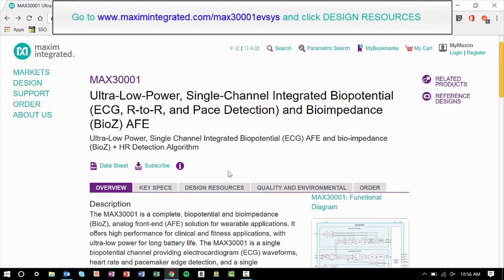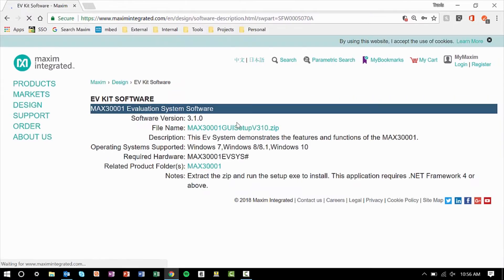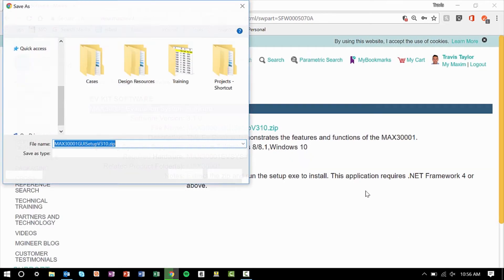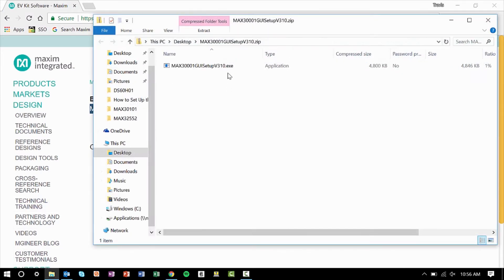The first thing we'll need to do is download the evaluation system software from the MAX30001 design resources page. To download this you'll need to agree to the license agreement and click download. Extract the zip folder and run the executable file to install the program.